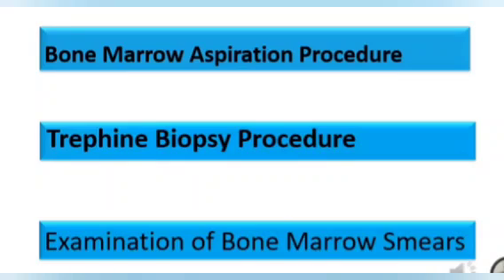We are focused on the red marrow during aspiration or biopsy procedure, or we are looking over the whole bone marrow for the procedure, because sometimes we do not get aspirates, like we only get a dry tap, and in that condition all the marrow is fibrous.